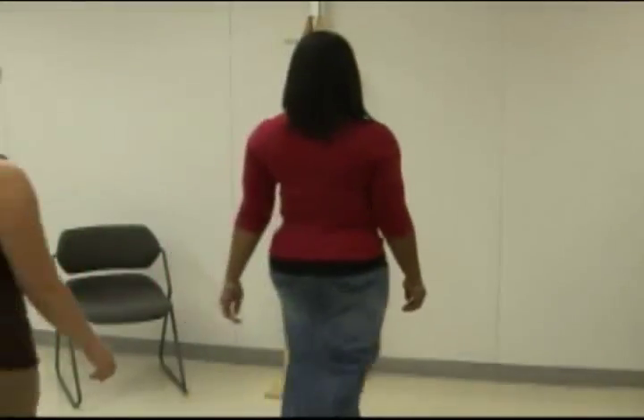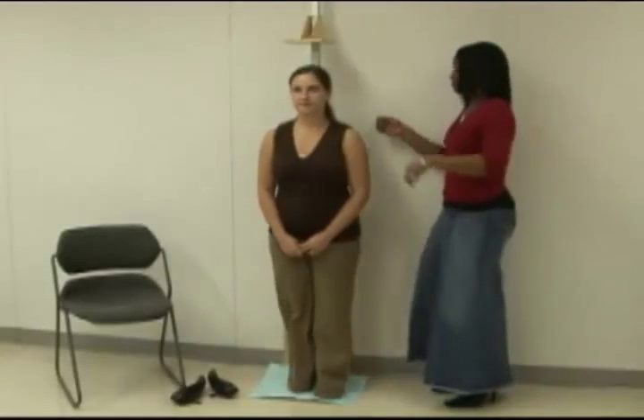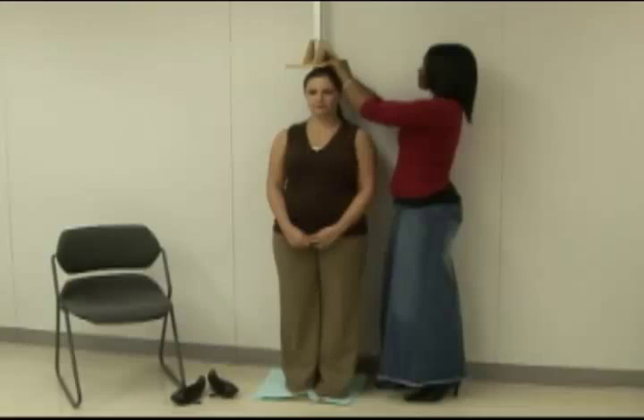And now we'll be measuring the height of an adult using a manual stadiometer. Before measuring, have the client take off her shoes and any heavy clothing she might be wearing. Since the headboard needs to rest flat against the client's head, make sure anything like hair clips or hats are removed. Remember, some hairstyles like braids can also prevent the headboard from resting flat and cause an inaccurate measurement. If this is the case, have the client do her best to flatten her hair, but if she can't, then just record that in the chart.